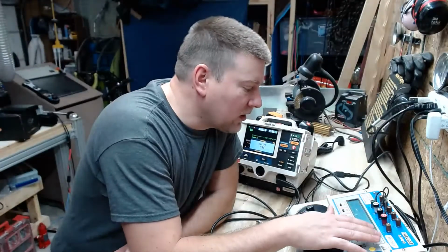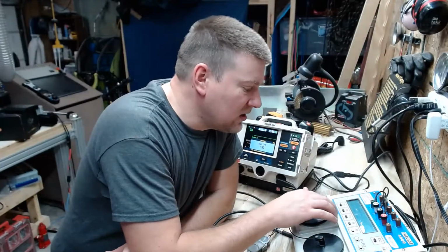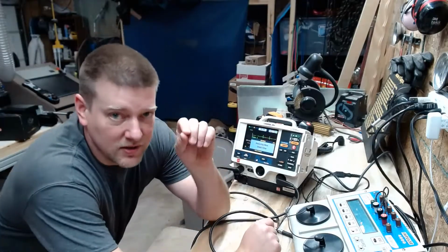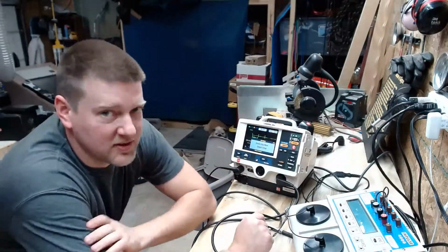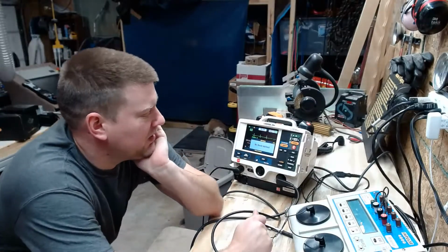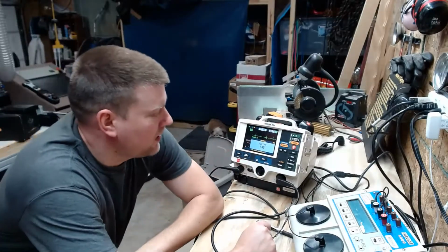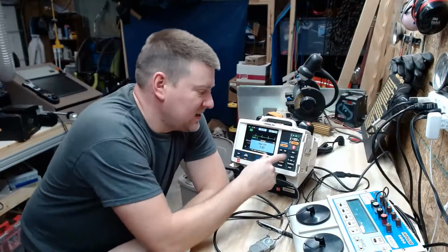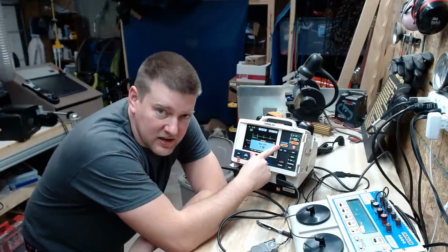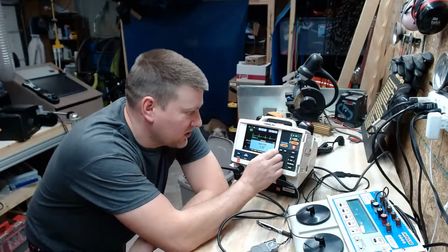The other thing that we are going to do is set it to ECG normal 60. 3, 2, 1, and we want to make sure that it does not shock with a normal sinus rhythm. No shock advised. Okay, there we go. Start CPR. So we've tested the sync. We have tested the AED mode and the analyze function.